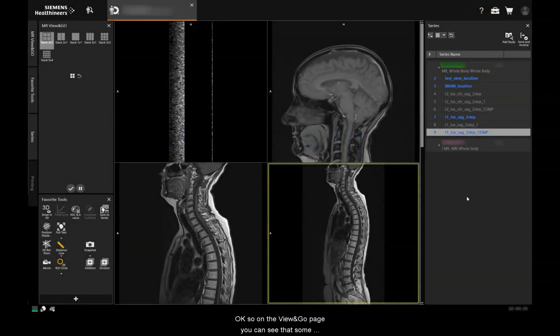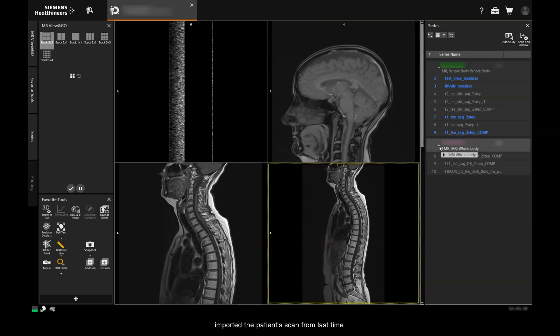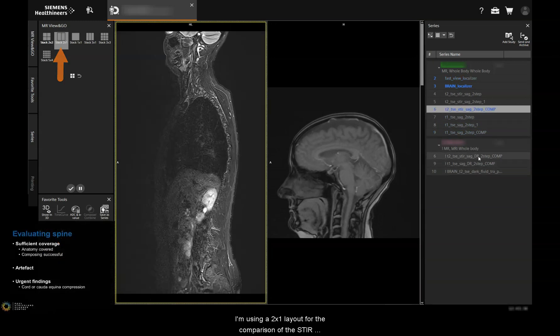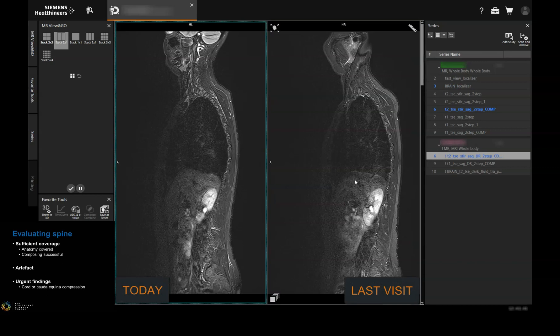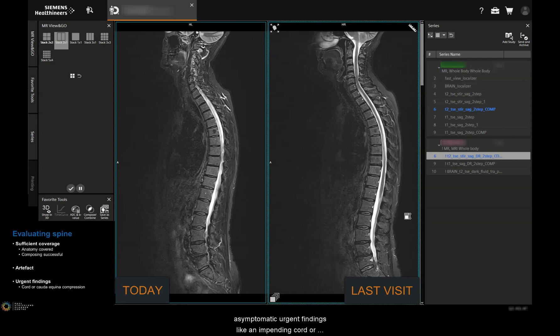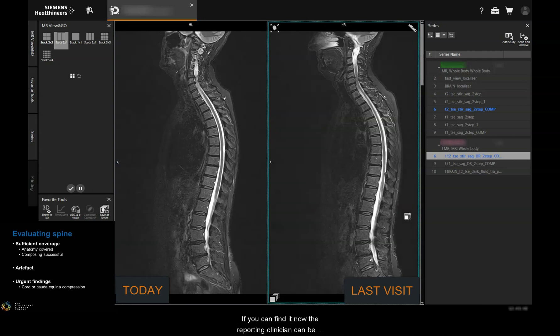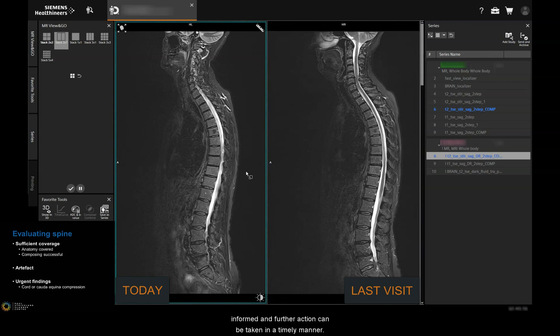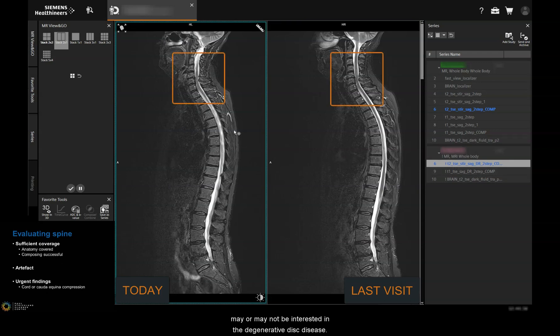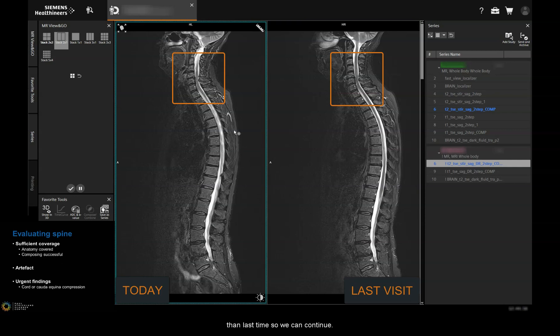On the view and go page, you can see that some images have already reconstructed and that I've imported the patient scan from last time. I'm using a two by one layout for comparison of the STIR sagittals from today and the last visit. Comparing images like this is crucial in detecting asymptomatic urgent findings, like an impending cord or cauda equina compression. If you can find it now, the reporting clinician can be informed and further action can be taken in a timely manner. Depending on the clinical indications, you may or may not be interested in the degenerative disc disease — in this case I've determined it's no worse than last time, so we can continue.